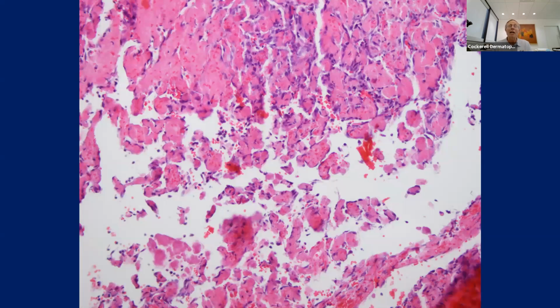Whenever you get a blood clot inside a blood vessel for one reason or another, when it undergoes organization, it looks like this. So it can sometimes simulate a neoplasm, but basically you look at the low power here also to help you make the diagnosis. This is a well-circumscribed lesion, and basically it's just a clot that's undergoing reorganization.